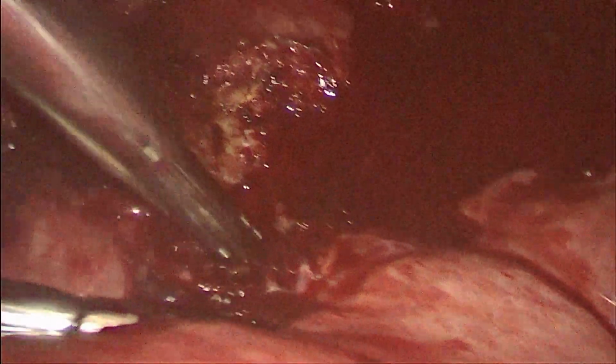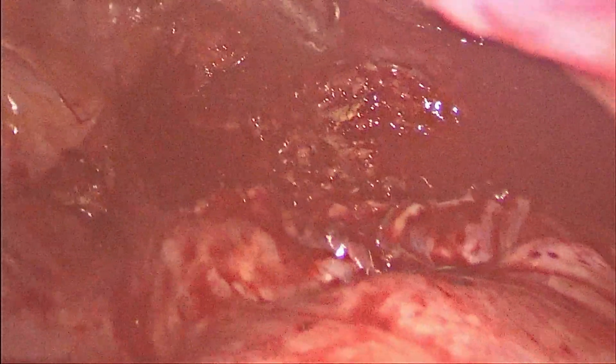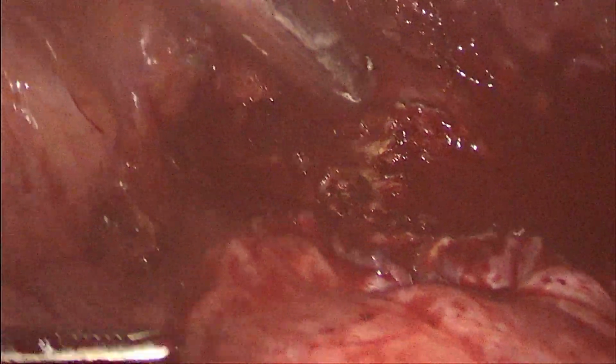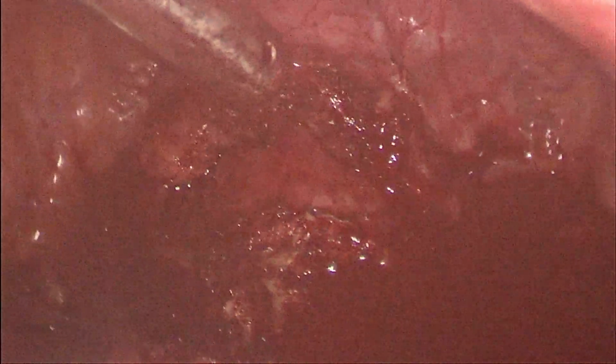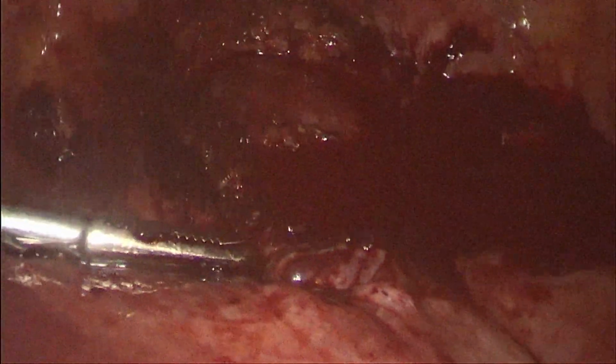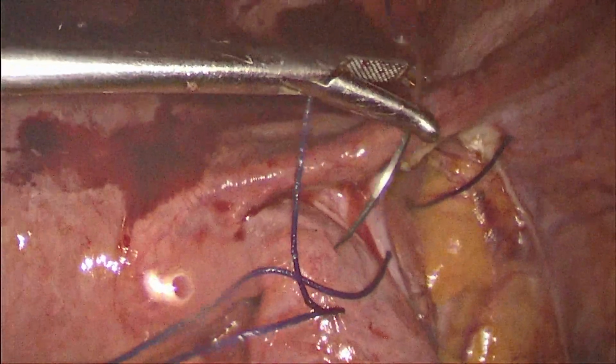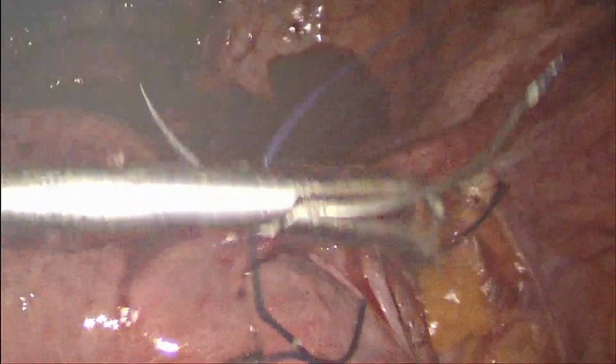The scar is excised. For confirmation, we are keeping the uterine manipulator so that we do not obliterate the uterine cavity. Or you can put a number 8 Hegar dilator into the cervical canal and pass it into the uterine cavity and approximate over that. So we are trying to introduce the uterine manipulator into the uterine cavity so that while approximating, we do not obliterate the cervical canal.